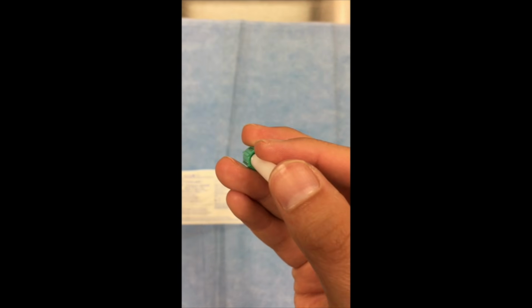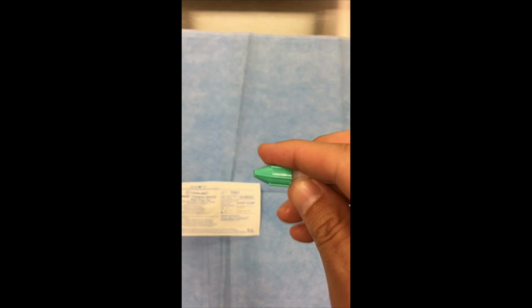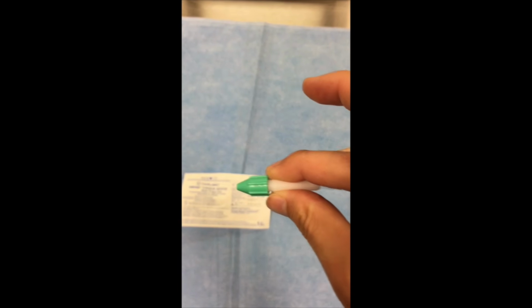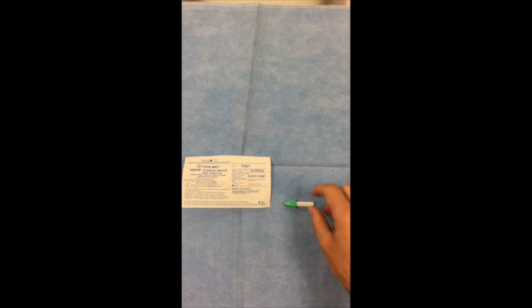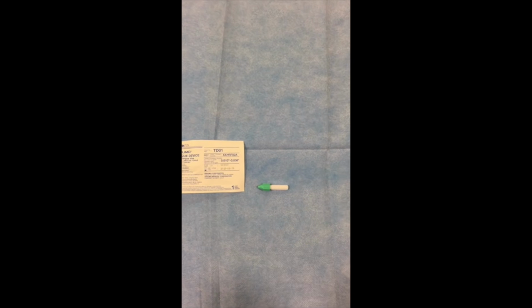So this is a torque device. One end goes here, and then the front end is here. And this is typically used on something like a Glide wire. So you put this over the Glide wire, and then that will tighten it. And now you have control of your wire. So if your wire is going into a catheter, you can move it in, and you can turn it very easily if the wire is slippery. So you almost always want to load that onto a Glide wire if you're loading up a Glide wire for someone.